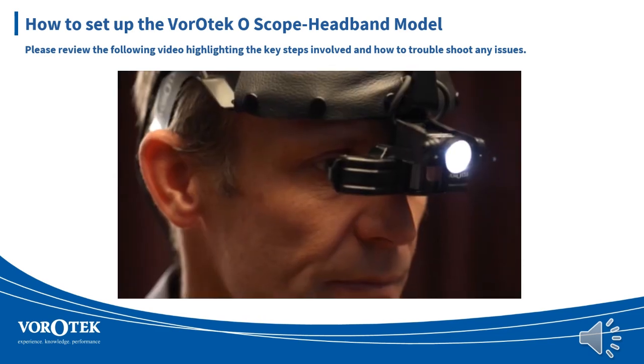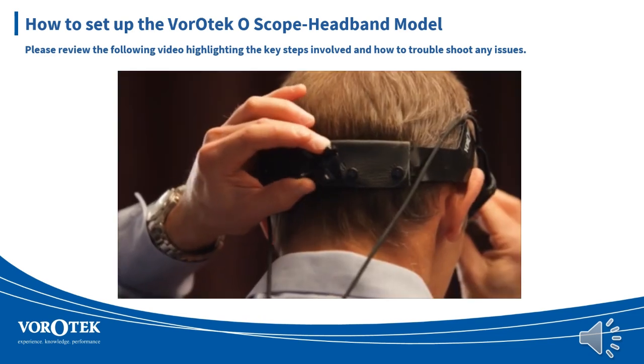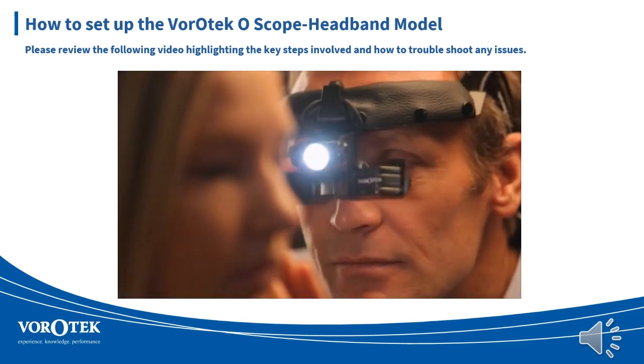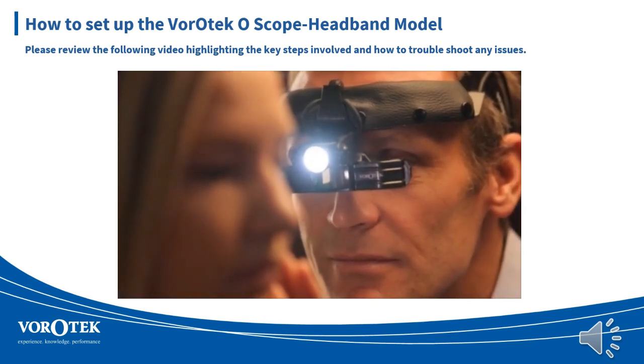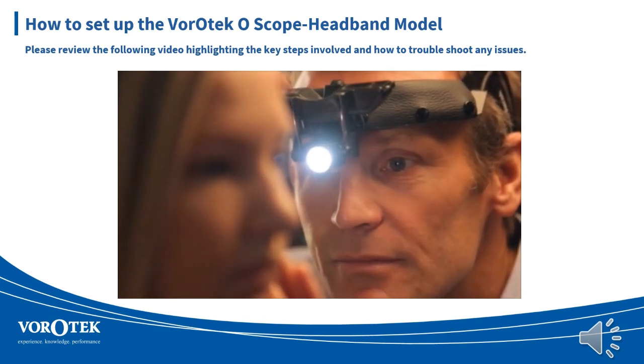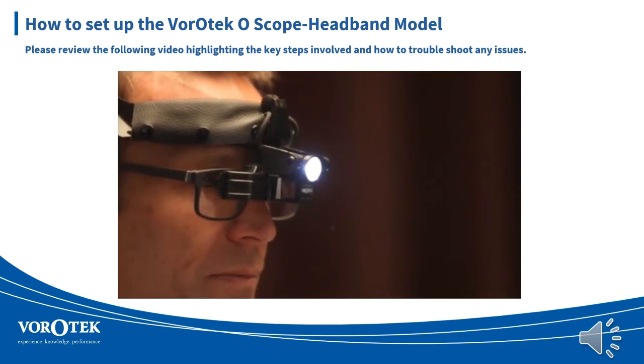The headband mounting bracket has two adjustable links allowing separate adjustment of viewing angle and forward positioning. The optics must be positioned as close to the eyes as possible. If the converged binocular optics are not in use and rotated up, then the illumination system can be angled further downwards. The headband can be used over glasses with a reading prescription.